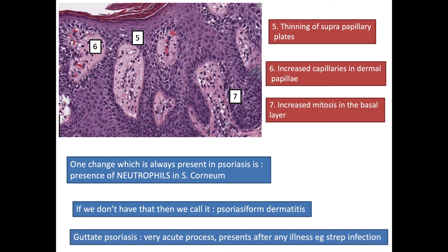For example, in guttate psoriasis — a very acute process which presents after any illness such as streptococcal infection in children — we don't see all the typical histopathological features of psoriasis, but we make a diagnosis of psoriasis on the presence of neutrophils in the stratum corneum. The presence of neutrophils in the stratum corneum is considered an essential feature to label it as psoriasis.